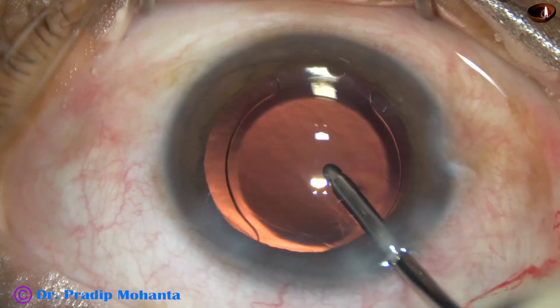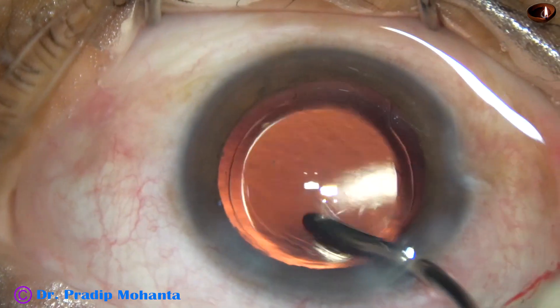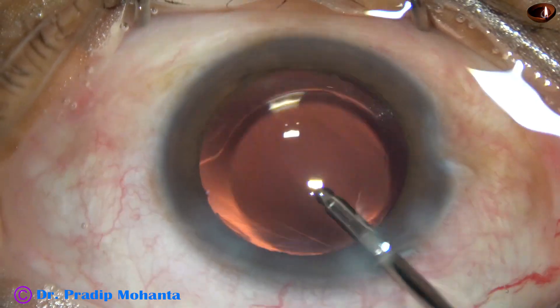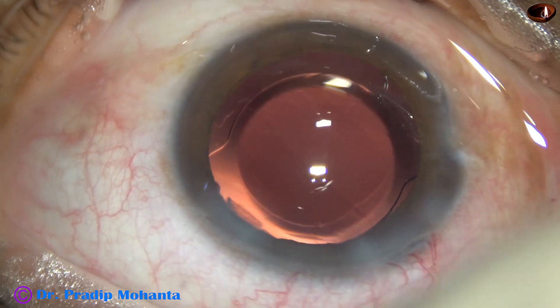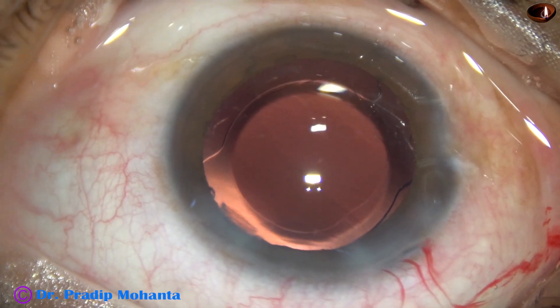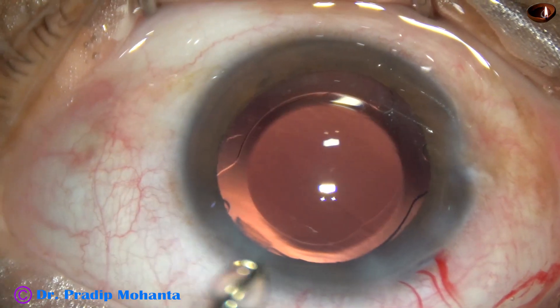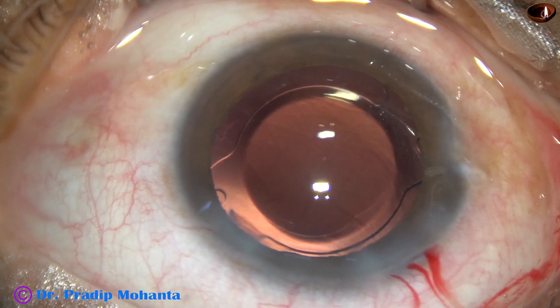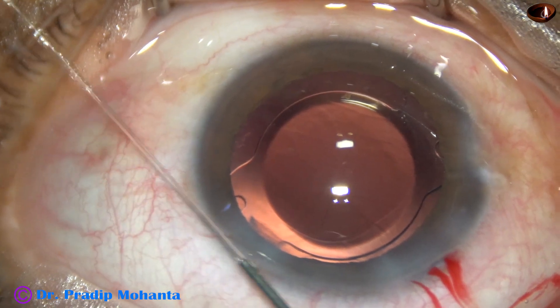It has come out — I hope this is the only nuclear piece. The pupil is nicely dilated, yet this quite large nuclear piece was hidden under the iris somewhere.